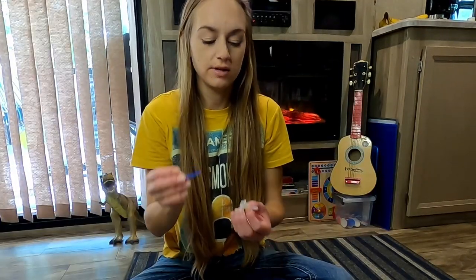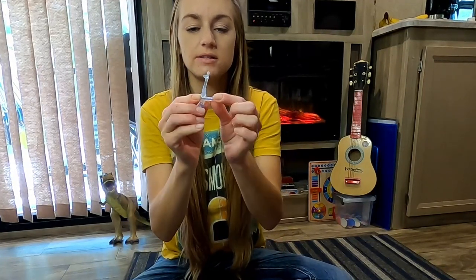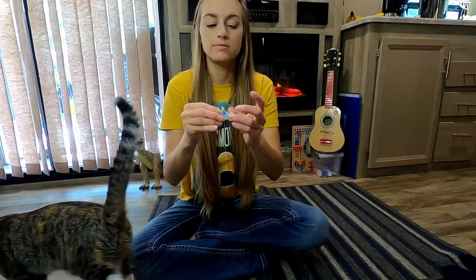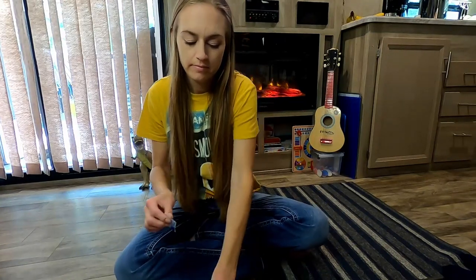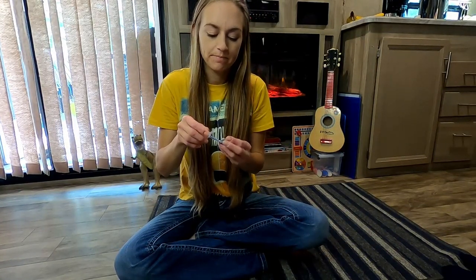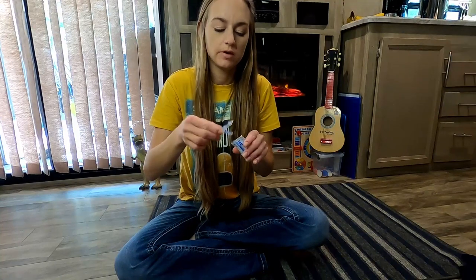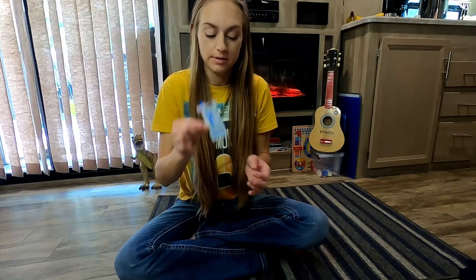I also use this little blue thing. What that does is it just goes inside the button like that. And it kind of makes it sturdier, so that when you're putting it in, it gives it a little resistance. It's not so wobbly and it's easier to put in. So that's what that is. We'll just leave that in there. And then the jelly. Did that even open? Oh, it did. So we just stick this in here. We're just going to leave that in there until we're ready to put it in.